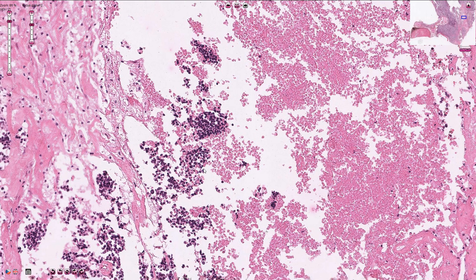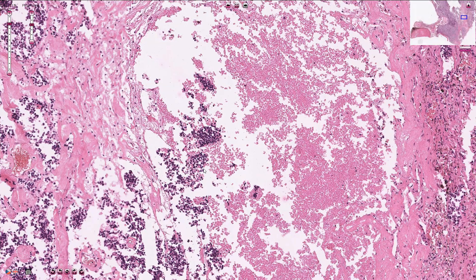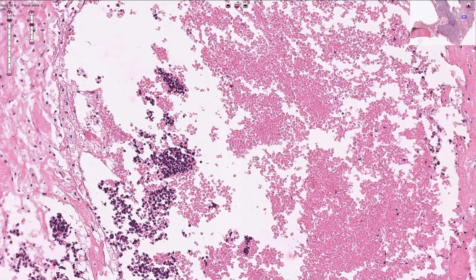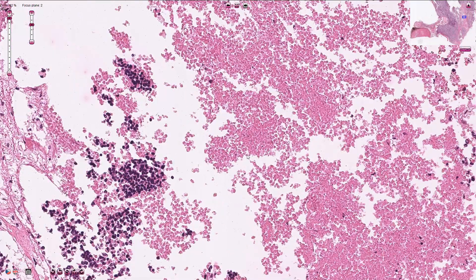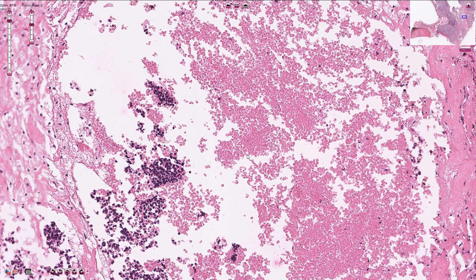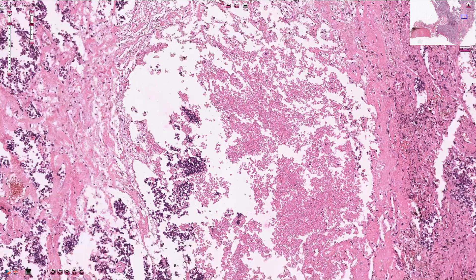Small cell carcinoma is typically a very aggressive and rapidly growing tumor and it is commonly associated with necrosis, so in this part of the slide we can see a necrotic area. It also metastasizes very early and therefore surgery is not recommended as the primary treatment.